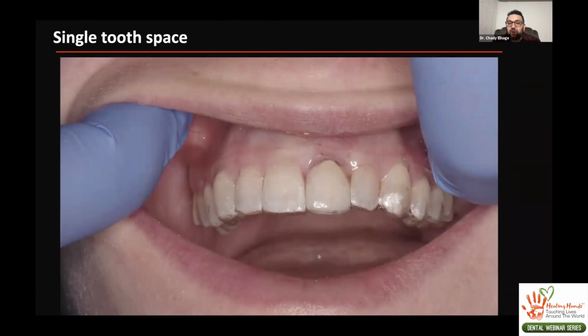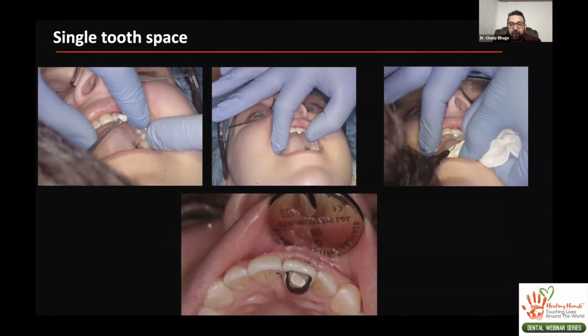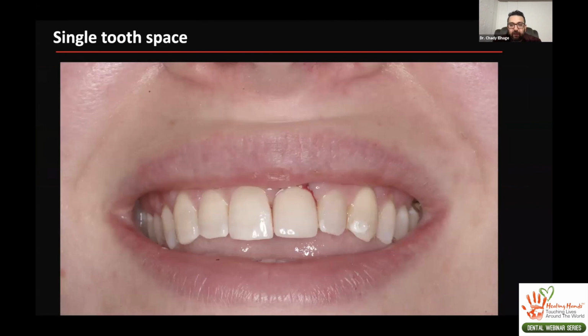And what I did was, once again, I took her crown off the tooth. I slowly drilled a hole through the backside of it. And I was able to fit it back in place with the retainer. And you can kind of see the backside there. I just fill some composite in there. And that's what the back portion looks like. And that's how she kind of leaves the office there.